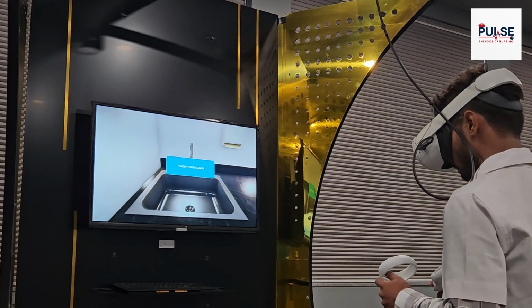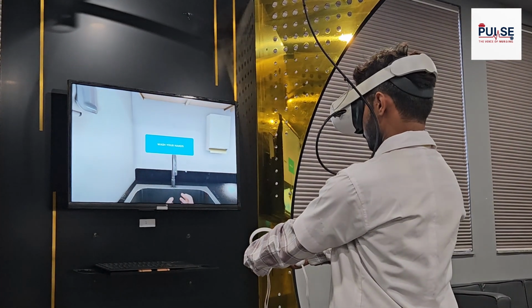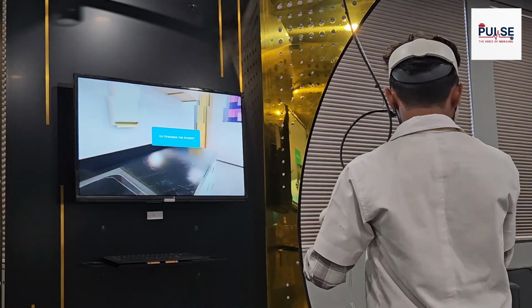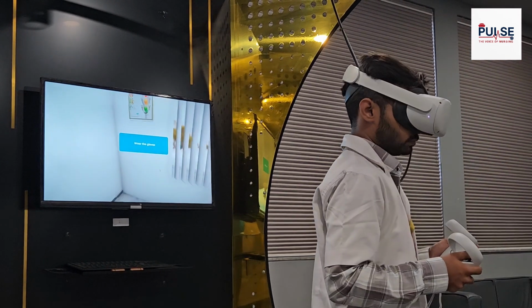Place your hands near the sensor to wash your hands. Go towards the patient. Wear the gloves.